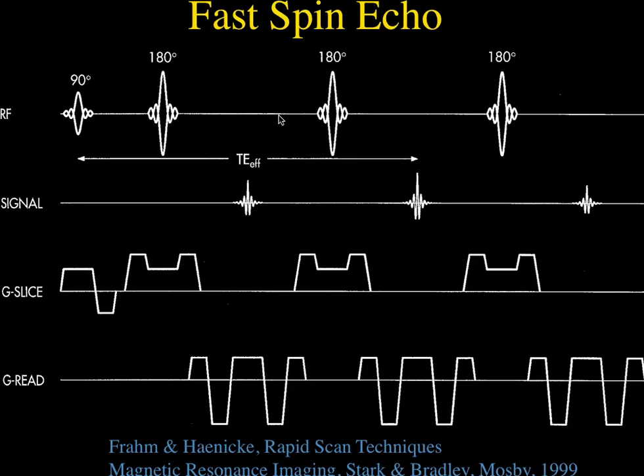Initially when they started, you'd start with a strong negative phase encoding, go up through 0, and then up to strong positive phase encodings, like we talked about before. But now it's turned out that for contrast, it's better to do the 0 K-space first, then go around the 0 K-space values, and not do the high levels of phase encoding until later, because they're not important for contrast.